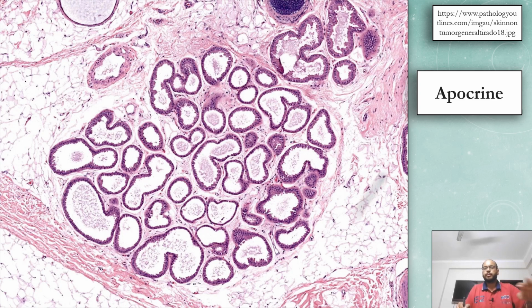So here you can see an apocrine sweat gland. Now remember how the eccrine gland looks inside a microscope. They are thicker walled, the lumen is smaller, it is multicellular lined, while in the apocrine the lumen is larger. You can see the cells have a very undulating or wavy appearance like this. Look at here, you can see this is a jagged appearance. Why? Because the top part has been pinched off. So that is known as apocrine secretion.